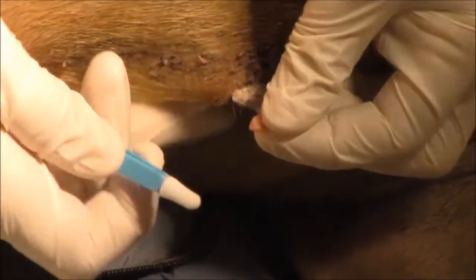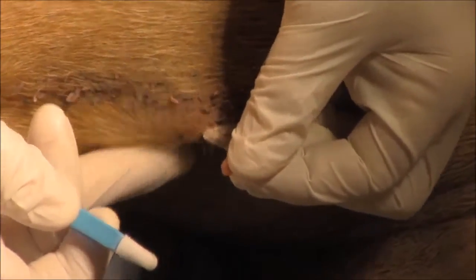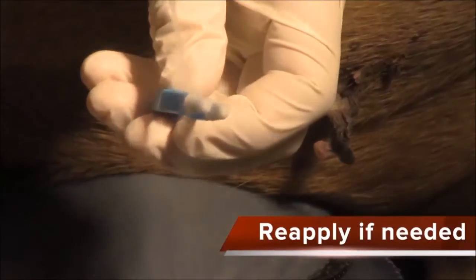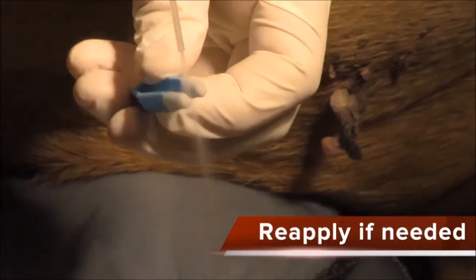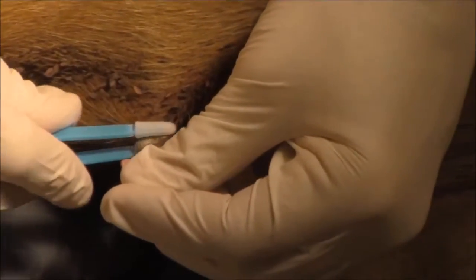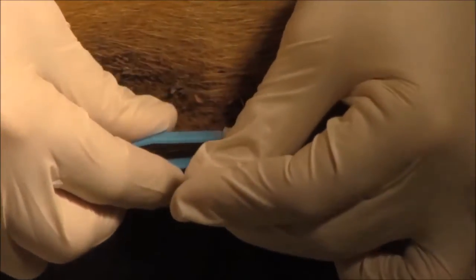You can see right here on the edge how that tissue is kind of dead and frozen up. I missed a little area so I'm going to do it again — let it sit for a second longer and put it back on.